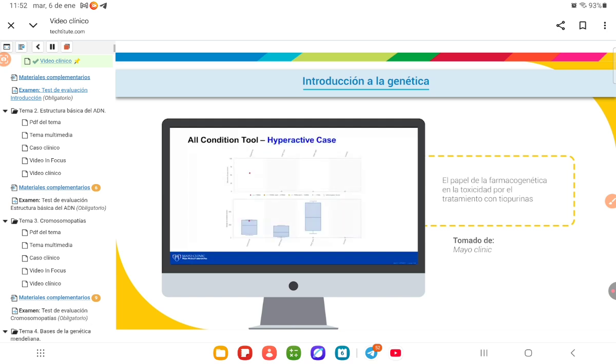The all condition tool consists of 2 sections, the percentile rank plot and the actual score plot. Shown here is a case informative for hyperactive status. All of the color-coded diamonds are directly linked to the one condition tool. A TPMT deficient case is expected to generate 2 informative scores, the milder condition, heterozygous, showing a higher percentile rank.